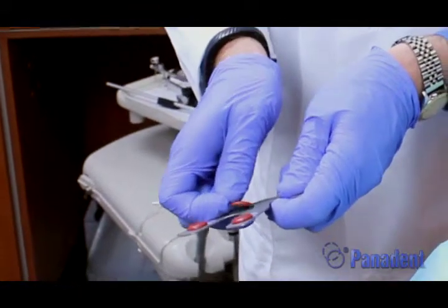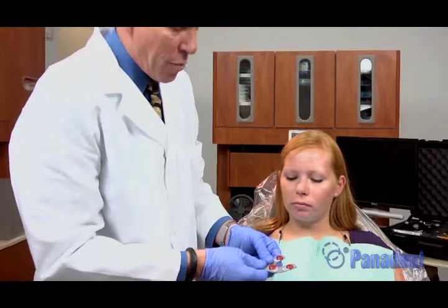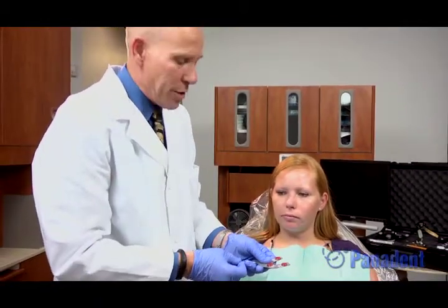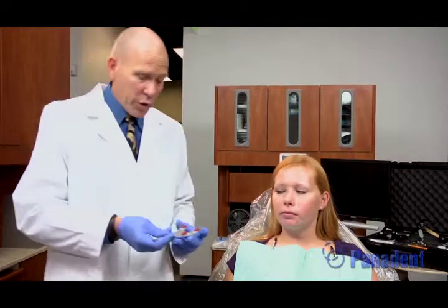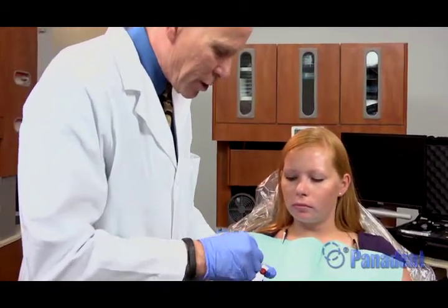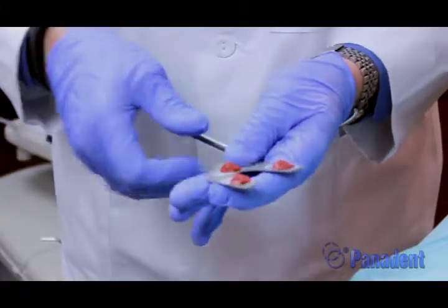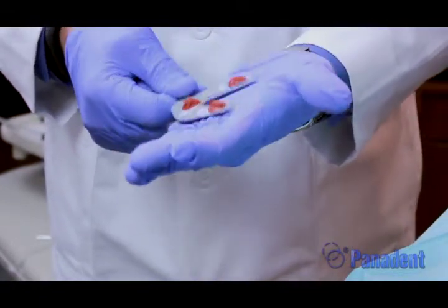Place one sideways there. Now we can temper this in hot tap water to soften the compound to get a registration of the maxillary teeth. I'm going to go ahead and temper that in hot water at this time. The compound is now tempered. I like to test to make sure it's soft — you can actually squeeze it into a cone shape at this point. I also want to make sure the stainless steel is not too hot for the patient, so I test it on my hand.